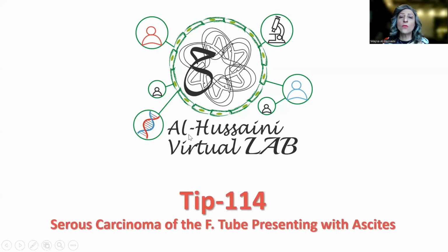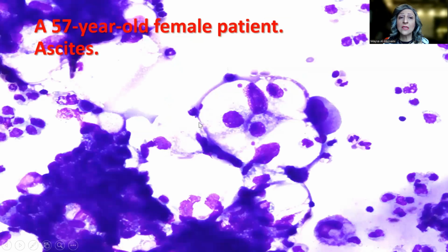What I'm going to be sharing with you today is a nice example of serous carcinoma of the fallopian tube presenting with ascites. This is a case of a 57-year-old female patient who presented with abdominal enlargement and pain and was found to have ascites, for which she underwent drainage. And this is the preparation from the ascitic fluid.